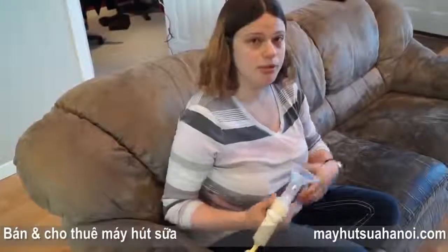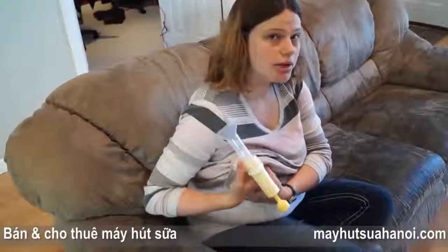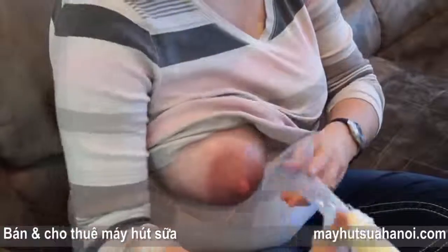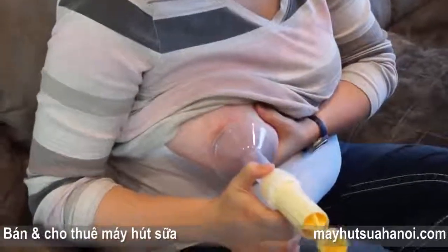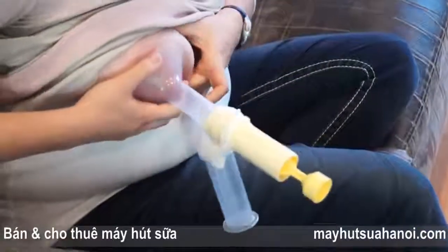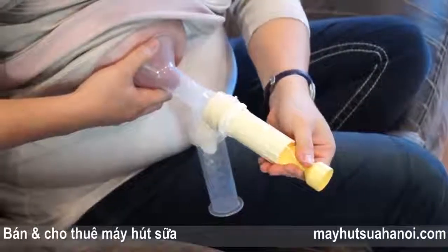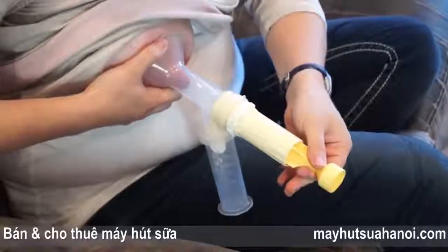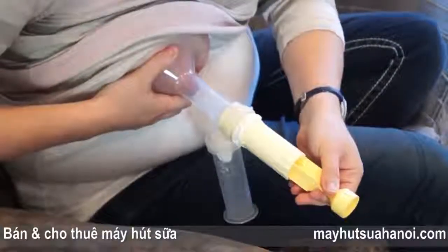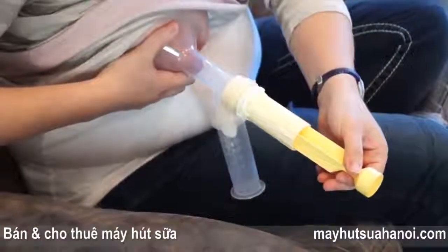Okay, so when you're ready to pump, you want to be relaxed and comfortable. And you want to maybe massage the breast a little bit, jiggle it a little bit to encourage the milk to flow. And then you put the flange so that you create a seal all the way around. And then it's usually helpful if you try to simulate the way the baby would get let down, which is some short, gentle squeezes, or in this case, pulls.